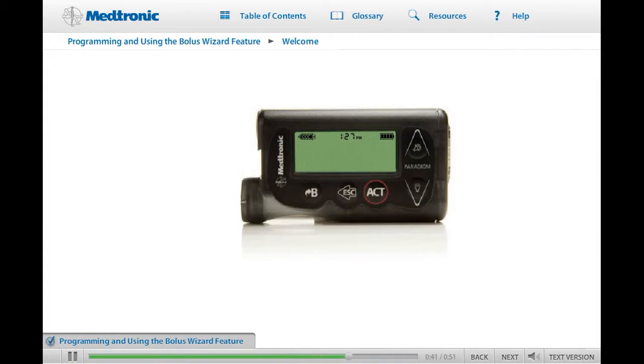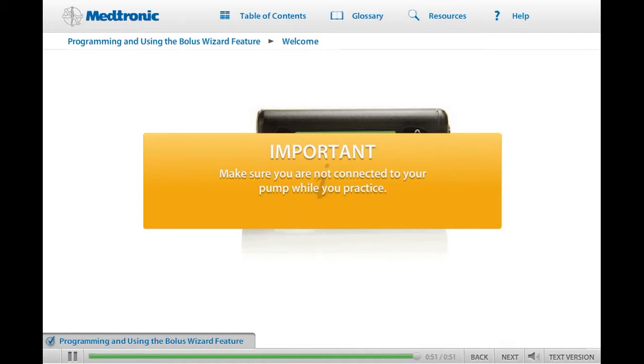If you have your pump available, we encourage you to follow along and practice the training exercises before you attend your in-person pump training. Make sure you are not connected to your pump while you practice.